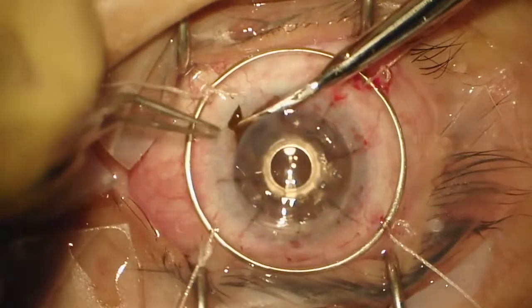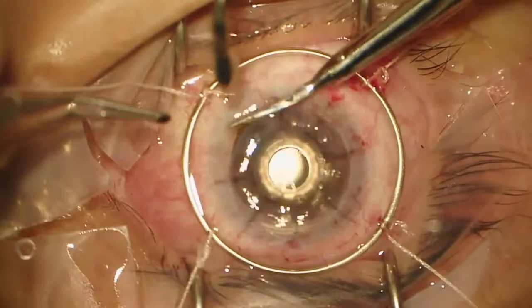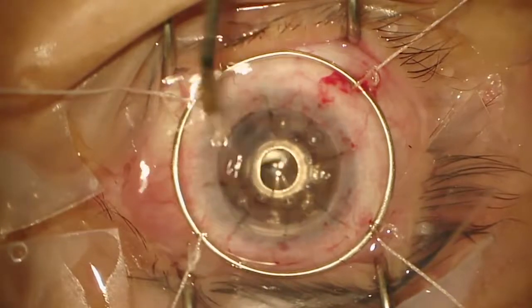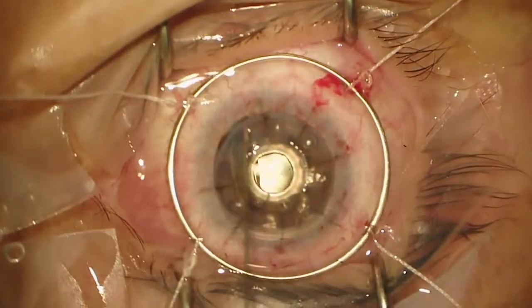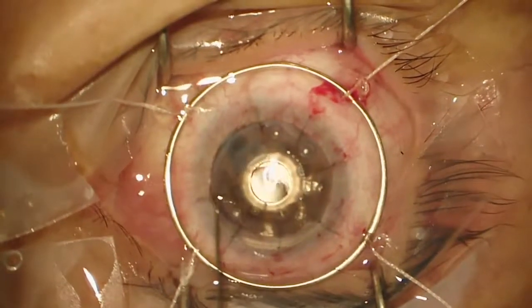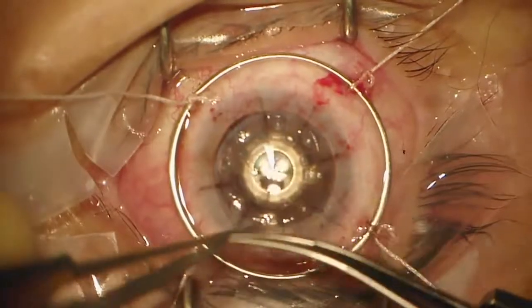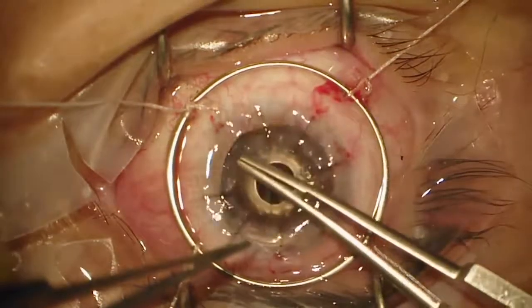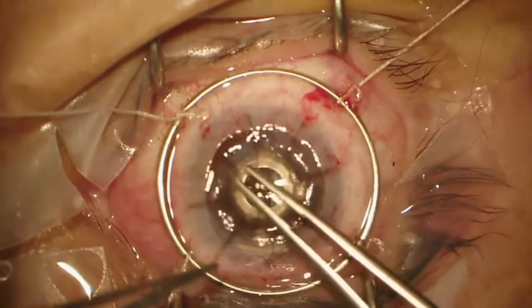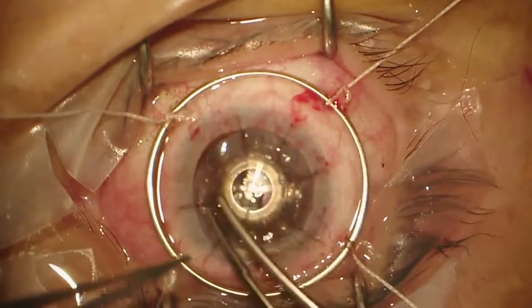Okay, so I'm going to make that little peripheral iridotomy now that we're closed. Okay. I can reach in and do that now. I couldn't really do that before because of the pressure. You can't pick up the suture on top of the polymethyl methacrylate. See? It won't pick up. You have to move it over to the tissue.